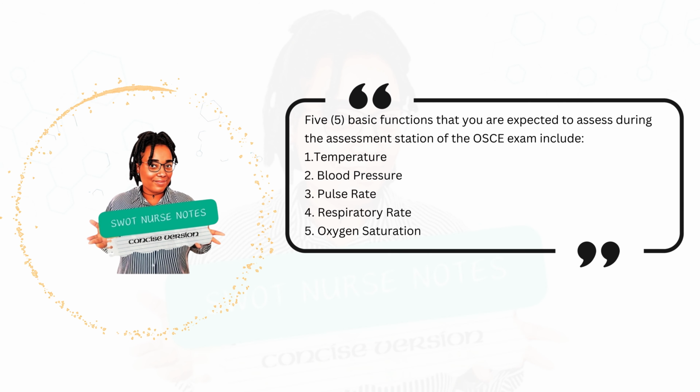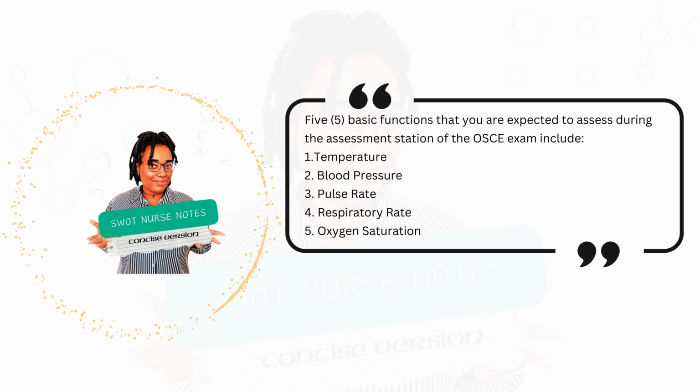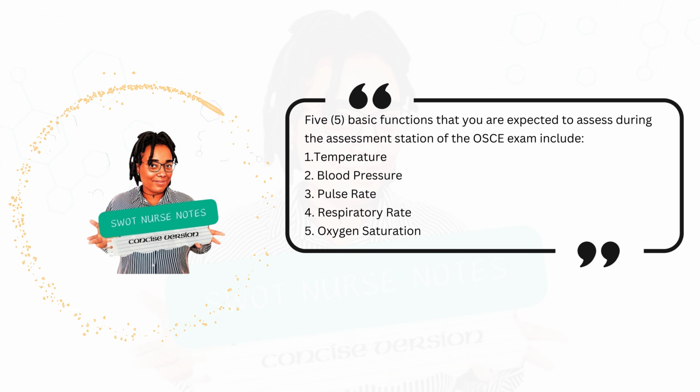There are 5 basic functions that you are expected to assess during the assessment station of the OSCE exam. These include: 1. Temperature, 2. Blood pressure, 3. Pulse rate, 4. Respiratory rate, 5. Oxygen saturation.